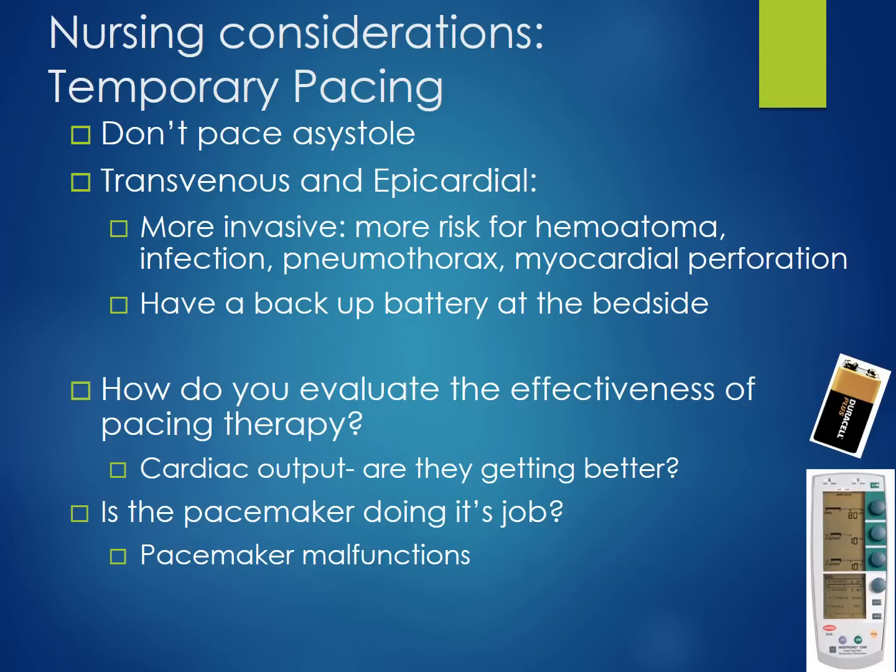So think back to basics. If the point of me pacing my patient is to increase their heart rate and truly improve their cardiac output, then I should start seeing signs of improved cardiac output. Now, on a second-by-second basis, I can look at that EKG strip and see if the pacemaker itself is doing its job. Is it delivering enough electricity? Is it delivering impulses at the right time? Is the patient's heart responding appropriately? And this is when we get into the nitty-gritty potential malfunctions of the pacemaker and how to watch for those. So we'll discuss those next.